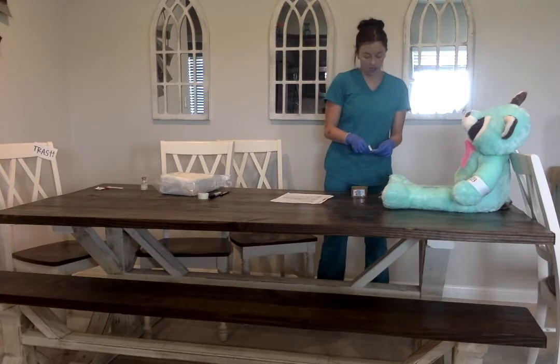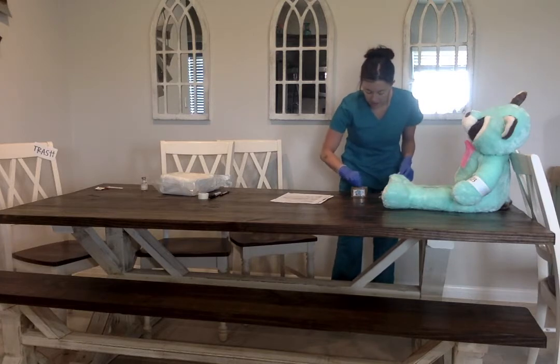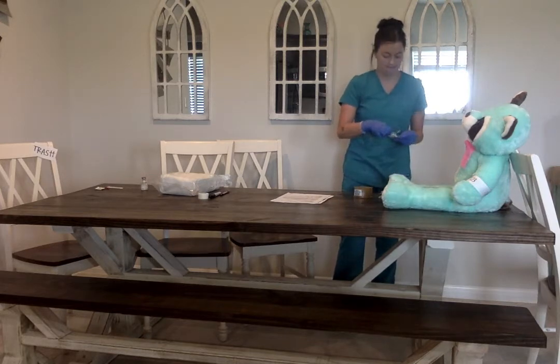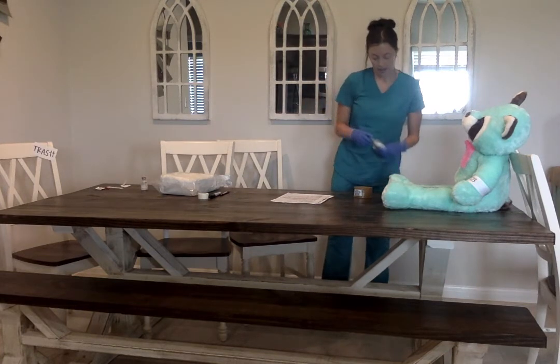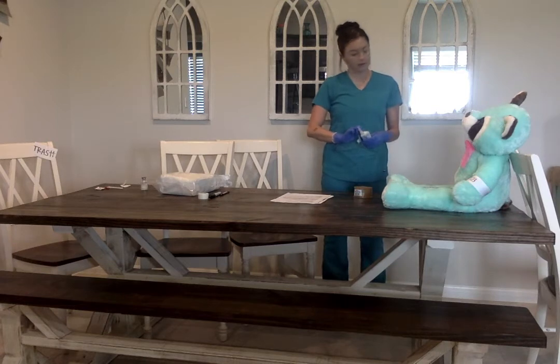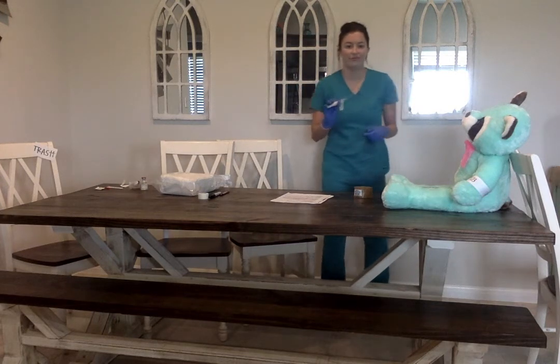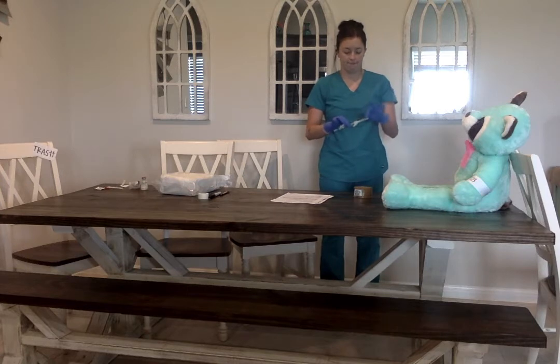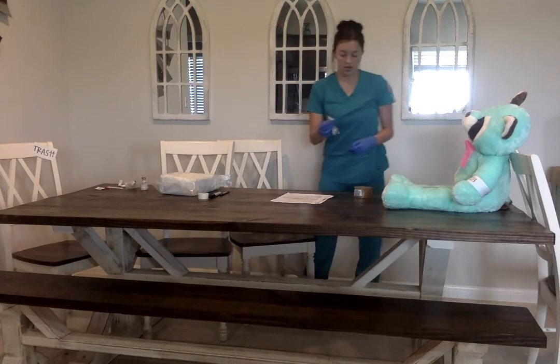I'm just going to start by cleaning your arm. Inner to outer for 30 seconds. Trash. Okay, gonna allow that to dry. Trash. Alrighty. Dispose of this in the trash. Alrighty.